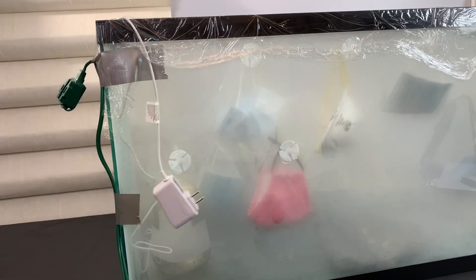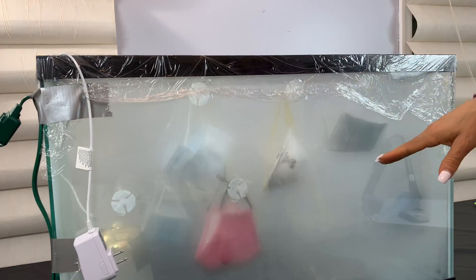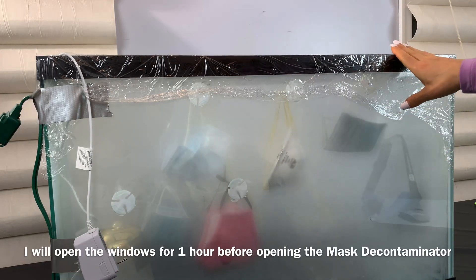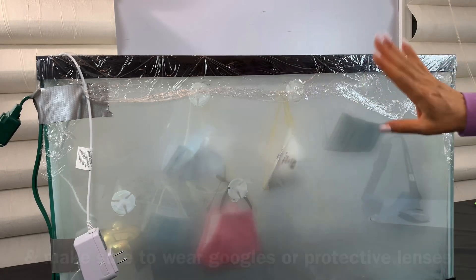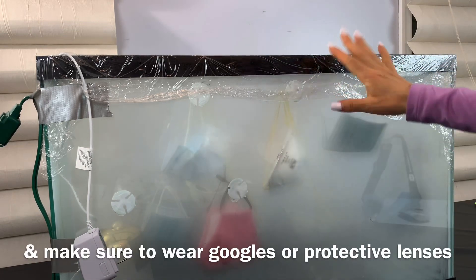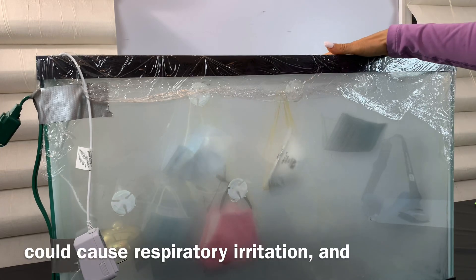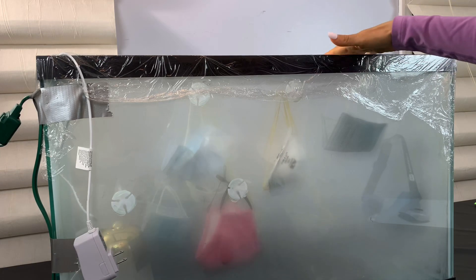I'm going to let the tank rest for today — it's nighttime right now. I'll come back tomorrow, open the windows in this room so fresh air is coming in and circulating, and then I will open the top, which inside is full of hydrogen peroxide mist.